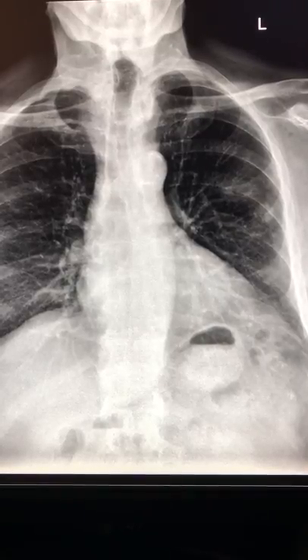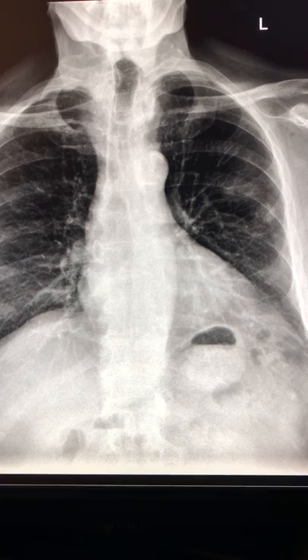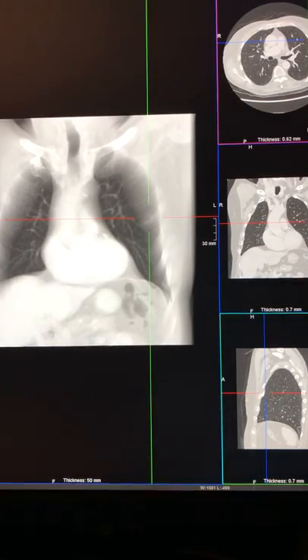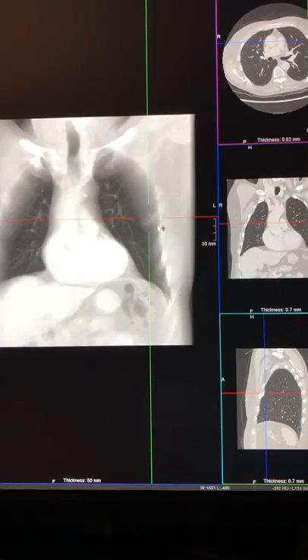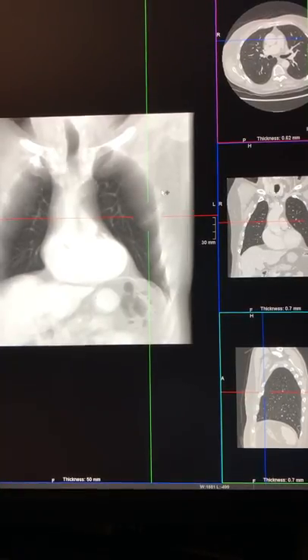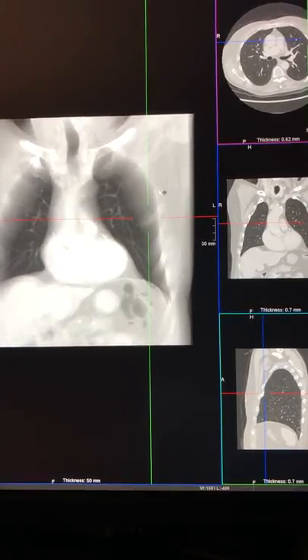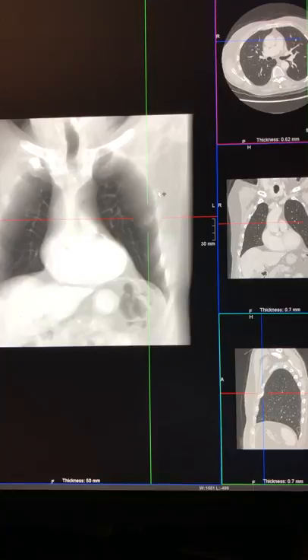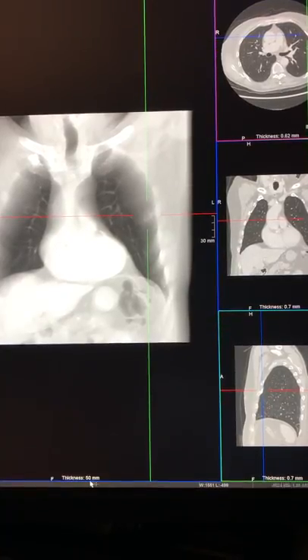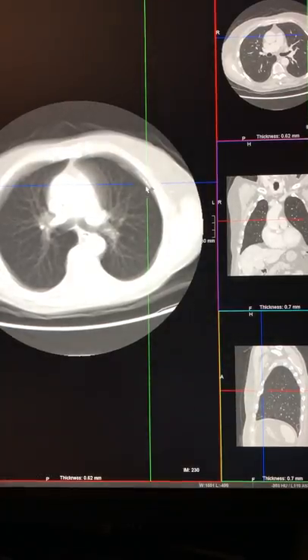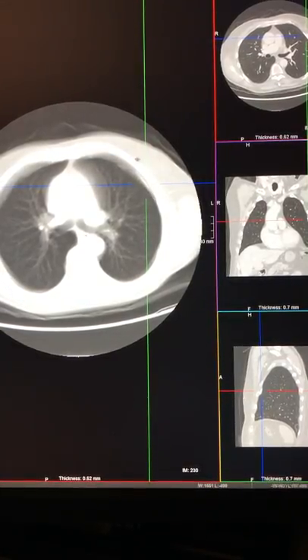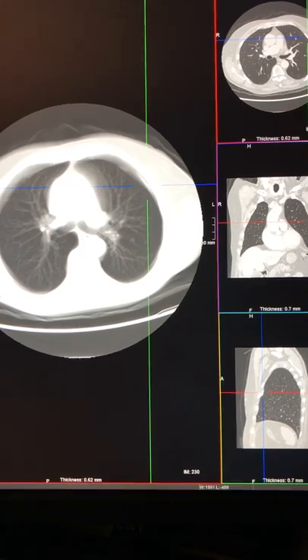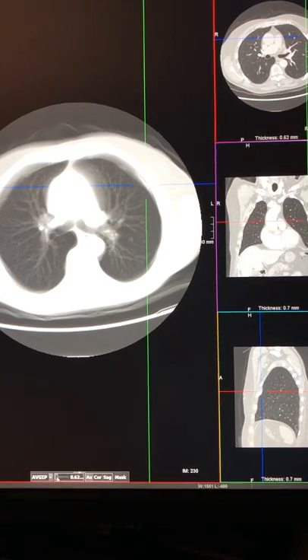We are going to look at the CT imaging of this patient, which in this case is an averaged image, and shows a similar density where you can see that it is represented by a calcific pleural plaque abutting the anterior lateral left costal pleural surface.